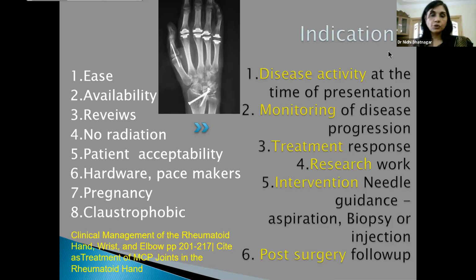Assessing the efficacy of the treatment response, where we have either the remissions or the exacerbations, and assisting in the research work, which is absolutely important because this is a very new subspecialty that is coming up and it's continually modifying. Then, of course, the interventions, which are ultrasound guided, and we all know the advantages of those: aspirations, synovial biopsies, or giving targeted steroid injections, or the PRPs for the treatment.